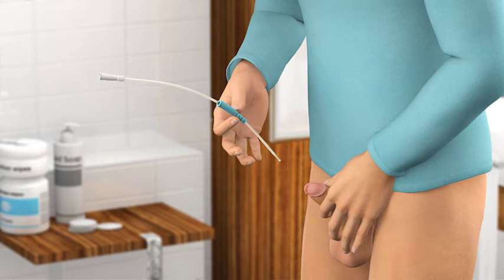Position the insertion grip approximately 10 to 15 centimeters from the catheter tip, so that you feel you can control the tip when inserting it into the urethra. While supporting your penis with your other hand, guide the tip of the catheter into the opening of the urethra.